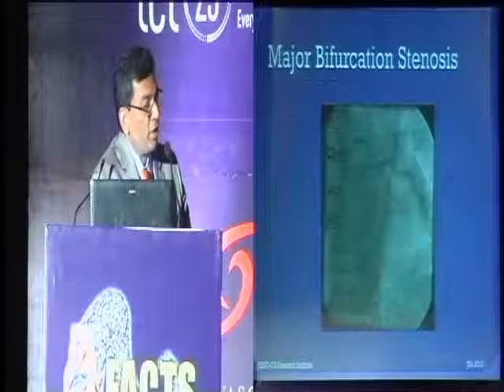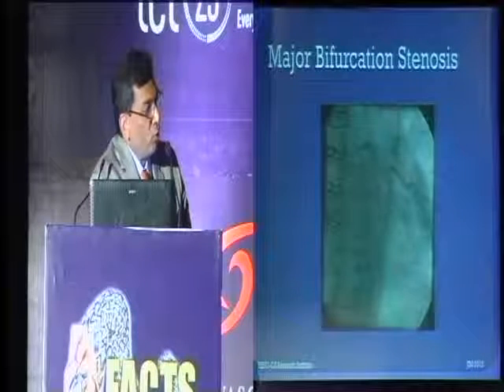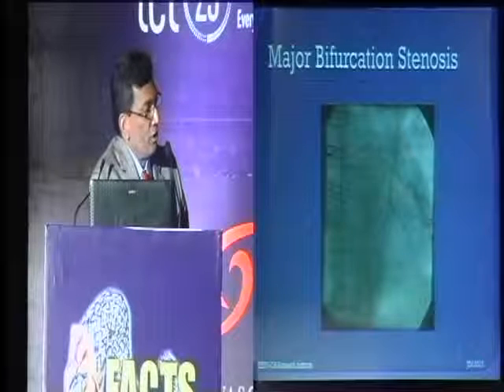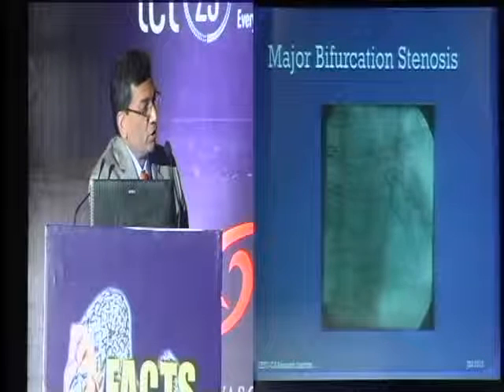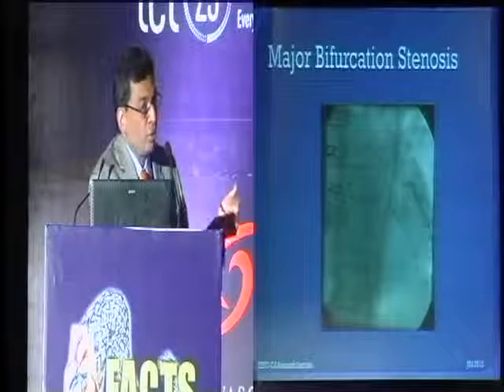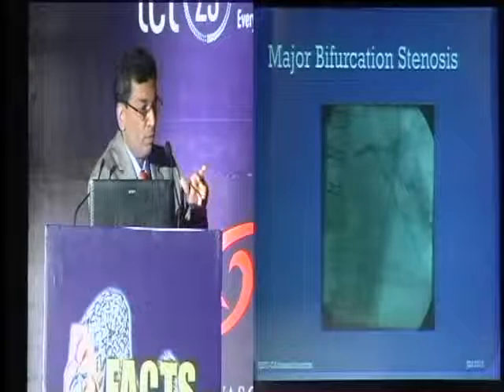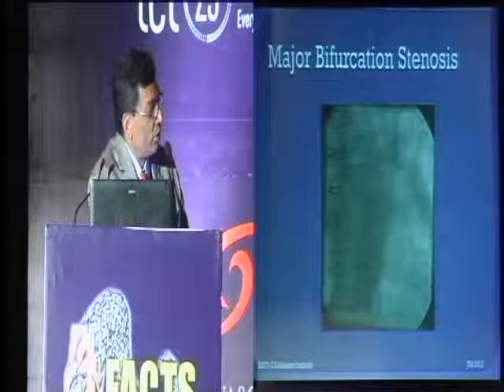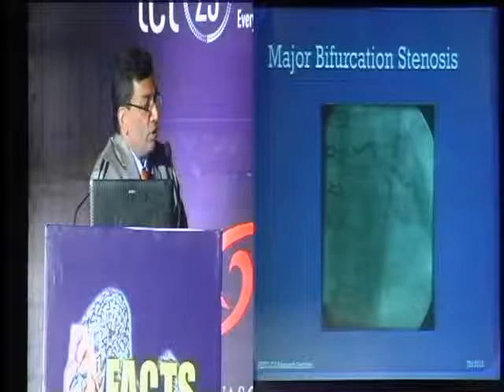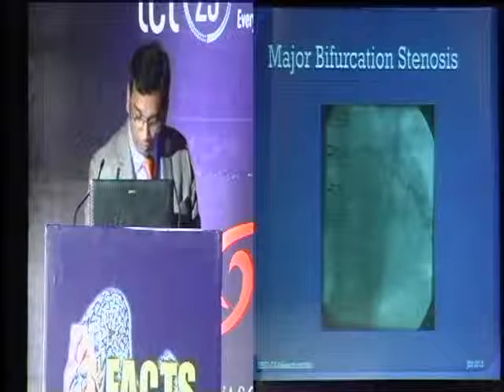The side branch is bigger than the distal circ, and it supports the right coronary artery, which has a vein graft that's diseased and previously stented. So the long-term patency of that vein graft in the future is not that high. So we have to keep in mind that we need to preserve these two branches at any cost. So we decided to go with atherectomy and then provisional stenting.